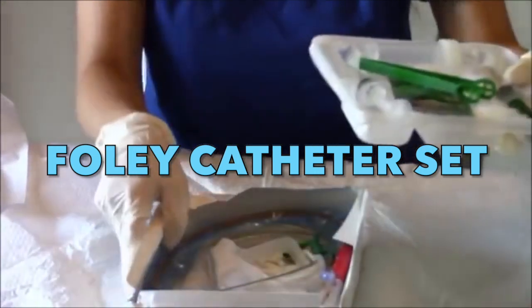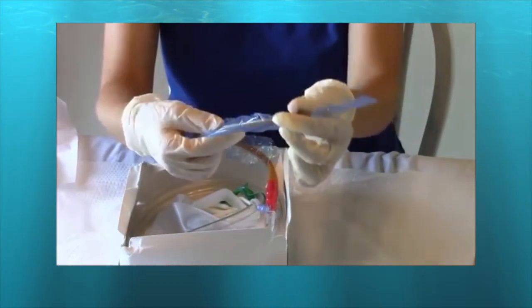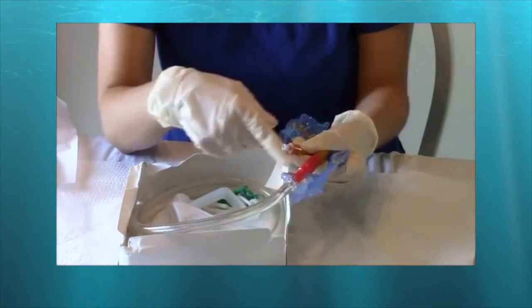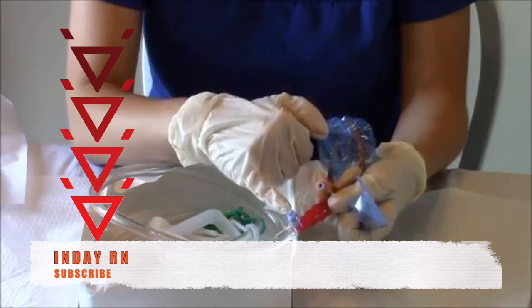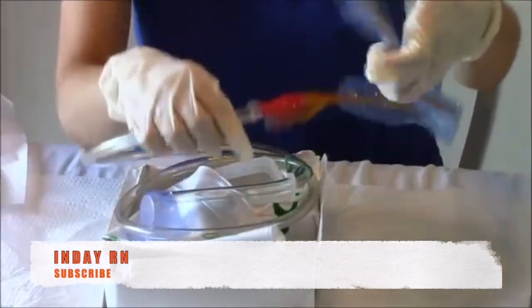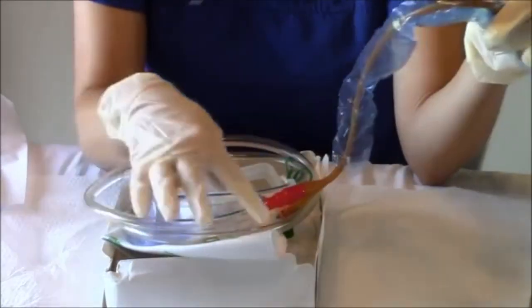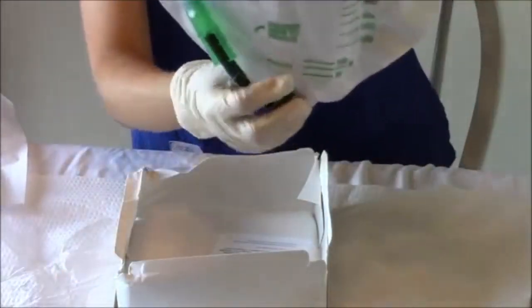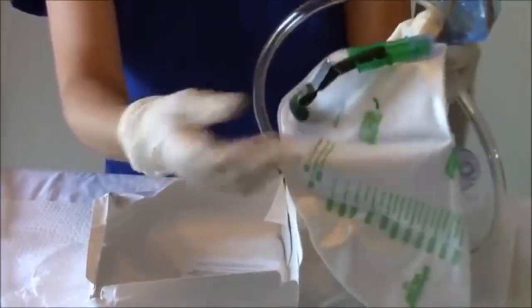At the bottom of the set is the foley catheter itself. Please note the appropriate size for your patient. On one port we are going to inject the 10cc sterile water to inflate the balloon, and on the other port we will collect the specimen. The covered portion is sterile; however, the other line going to the urobag is already clean. We will use the drain area to empty the urobag.